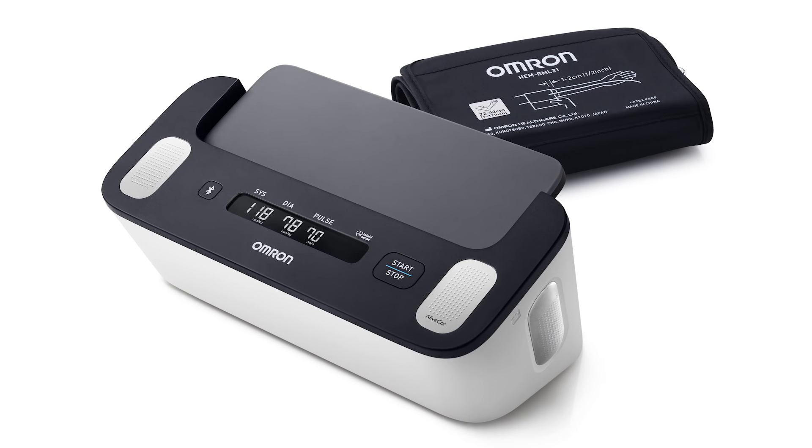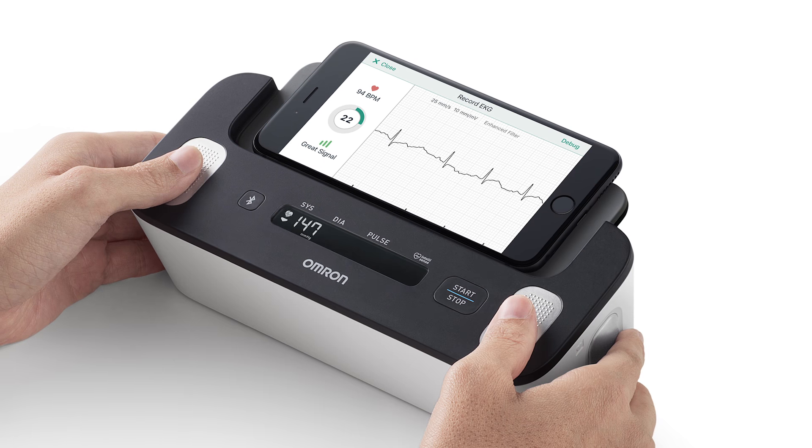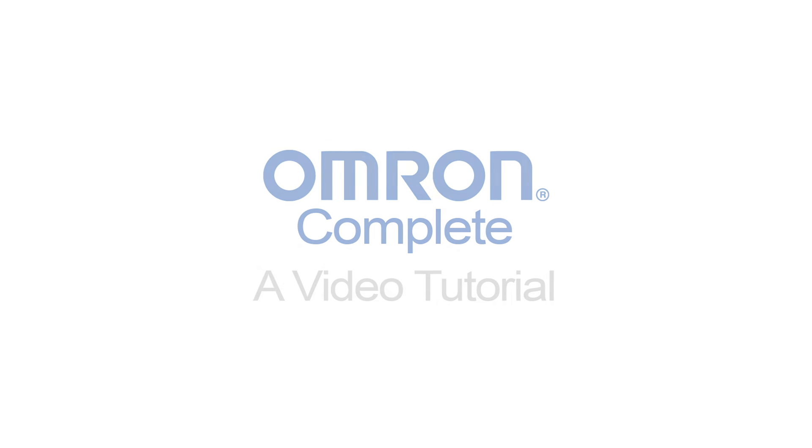Omron Complete combines blood pressure monitoring with EKG measurement in one easy-to-use device. In this short video, we demonstrate how to record measurements step-by-step.